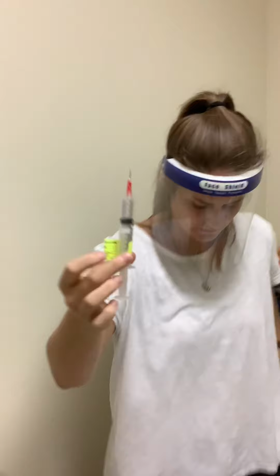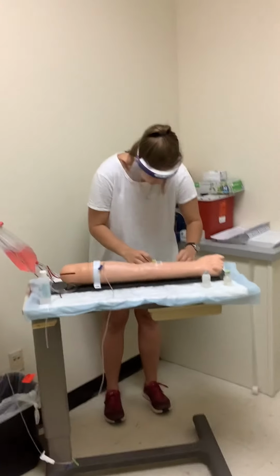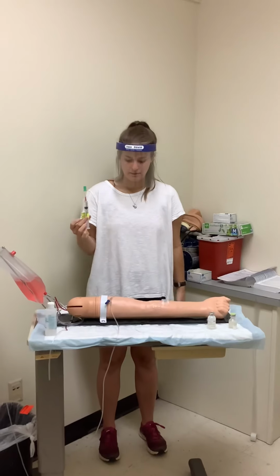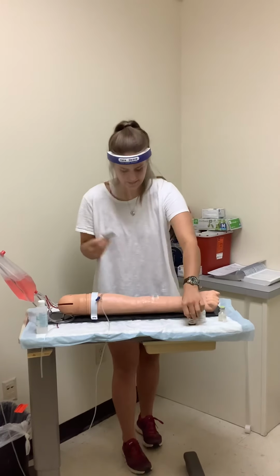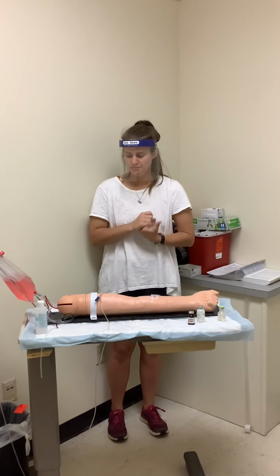Alright, I'm checking that it is 4 milliliters, and I can then recap by scooping it. So I've got my medication ready. I've got my alcohol pad, and I can now enter the patient's room.